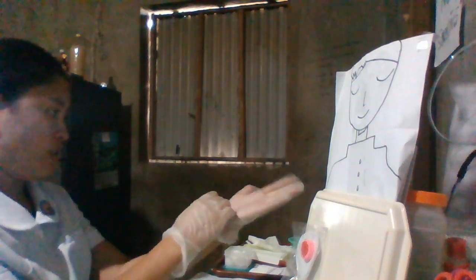After applying gloves, we need to help the client to assume a position based upon his choice, such as side lying, supine, or standing position.